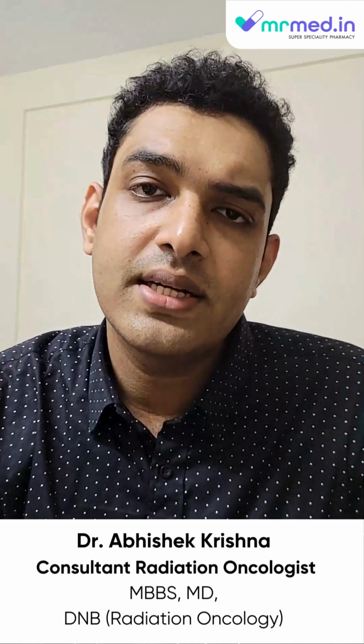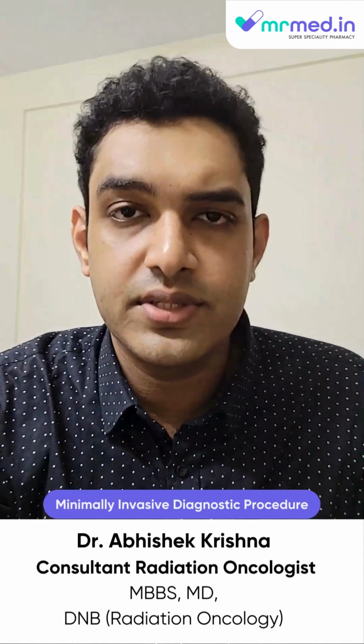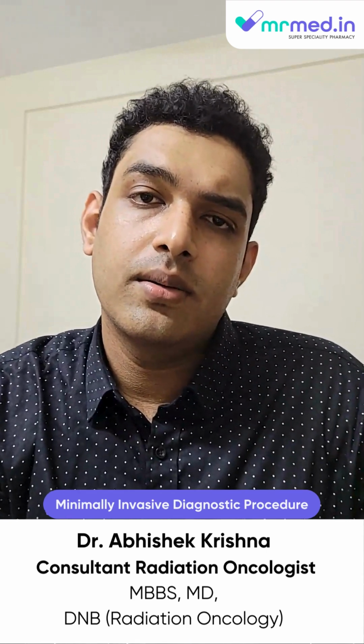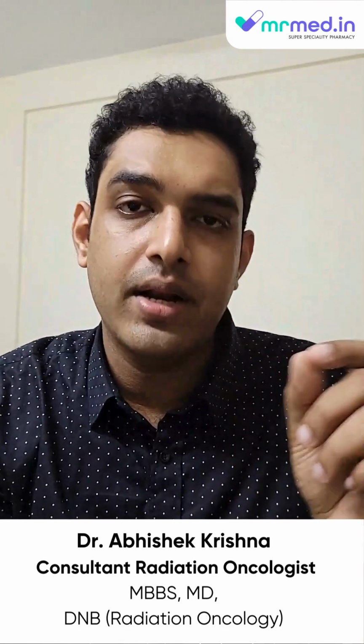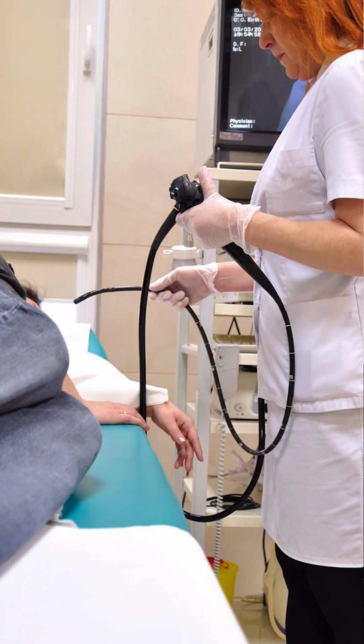So endoscopy is a type of minimally invasive diagnostic procedure by which we insert a small tube that has a camera at the end of it, either through the mouth to visualize the oral cavity, throat, the esophagus, the food pipe, the stomach, etc., or to visualize the colon, rectum. We insert the tube through the rectum. So most commonly, endoscopy is synonymous with upper GI scopy, that is, the tube is inserted through the mouth.